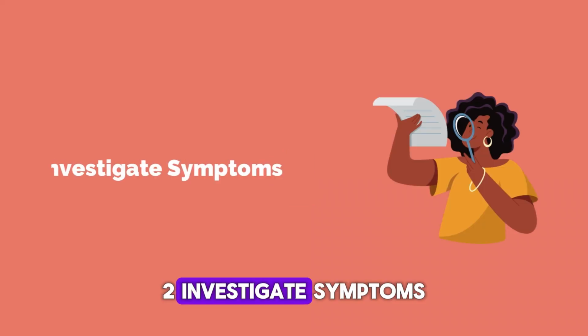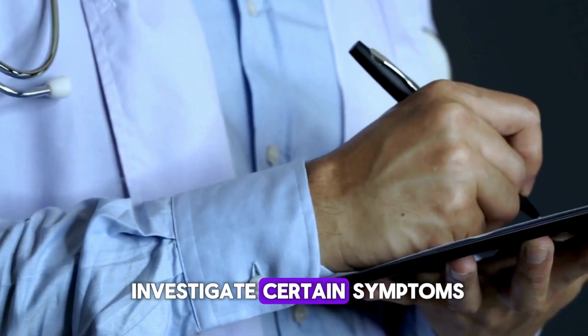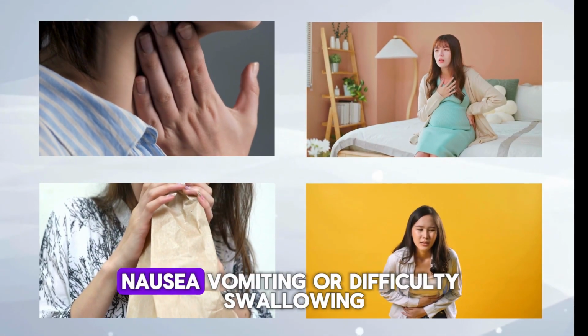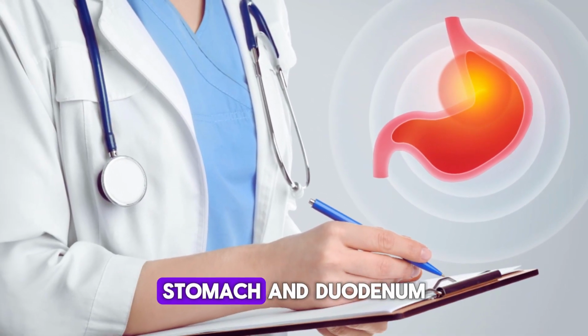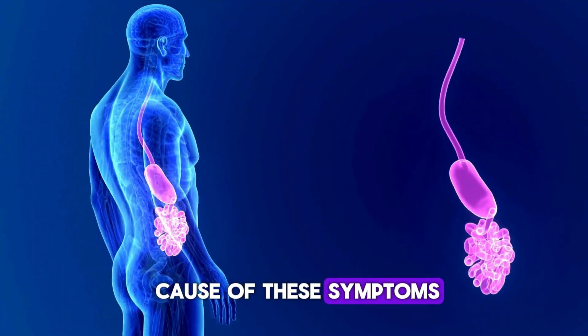2. Investigate symptoms. Gastroscopy is often used to investigate certain symptoms that suggest problems in the upper gastrointestinal tract. These symptoms include persistent upper abdominal pain, nausea, vomiting, or difficulty swallowing. By directly visualizing the esophagus, stomach, and duodenum, doctors can identify the cause of these symptoms.